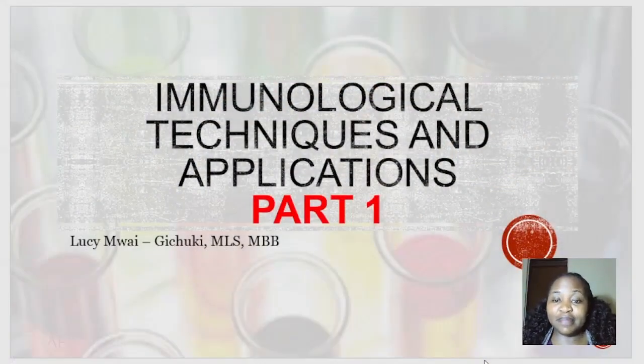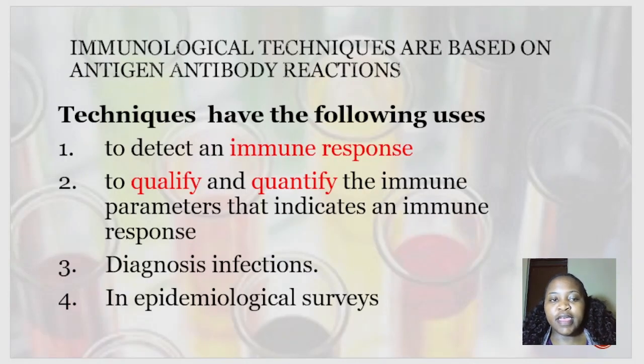Immunological techniques and applications. This is a continuation of the introduction to immunotechniques. Immunological techniques are based on antigen-antibody reactions, and these techniques can be used for the following uses.